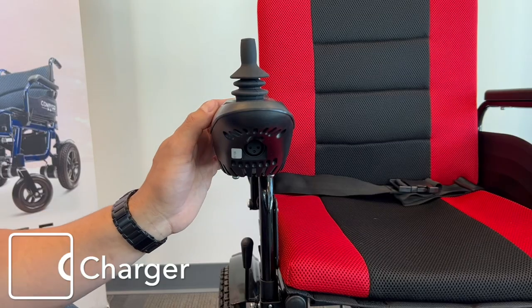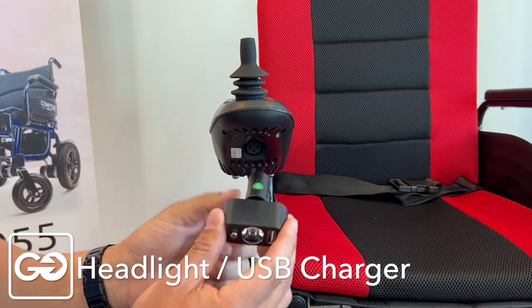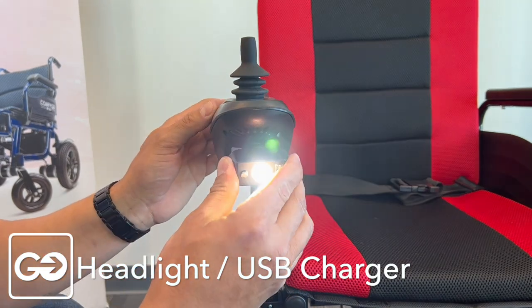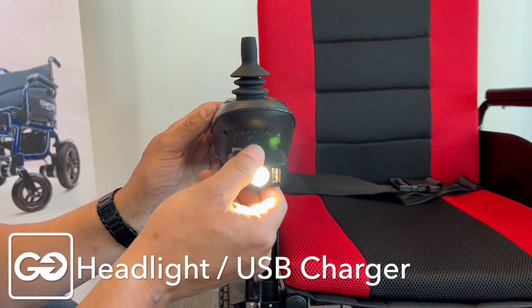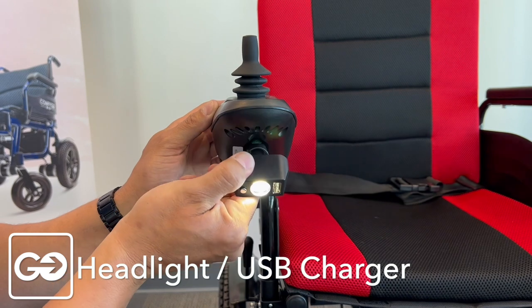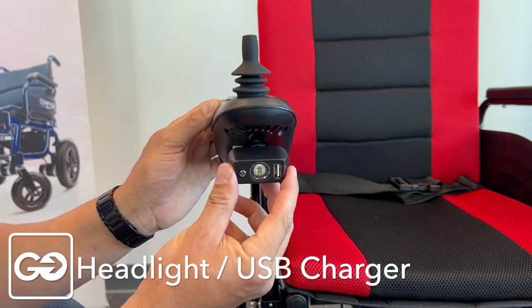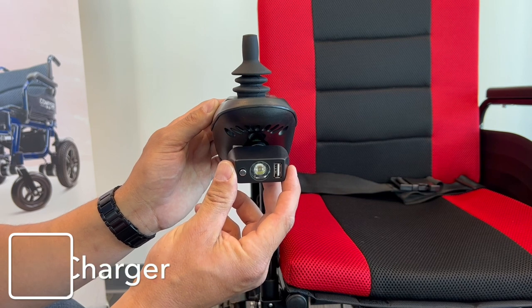Your X9 will come with this flashlight and USB adapter — it's really neat. This plugs right into our USB port just like this. We have a light that swivels down and up to light your way as you're going through dark areas. And what's really neat is you can turn this off and use this as a USB charge port for your tablet or iPhone.